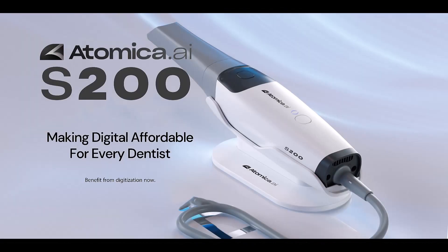Hello everyone, and welcome to Atomica S200. This is a demonstration on how to scan a diagnostic full-arch scan using the Atomica S200 intraoral scanner.